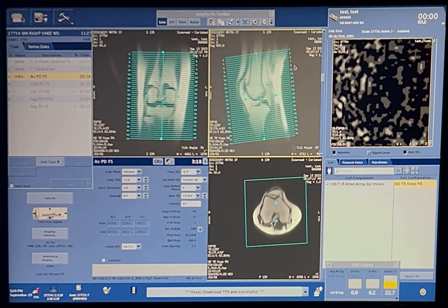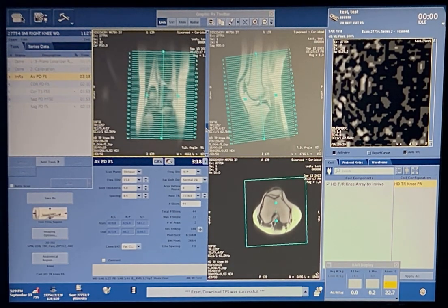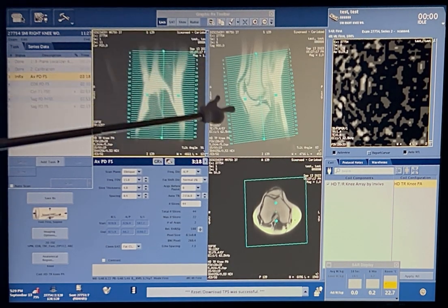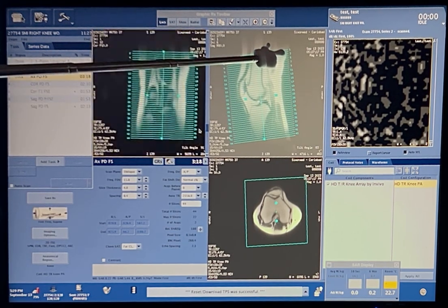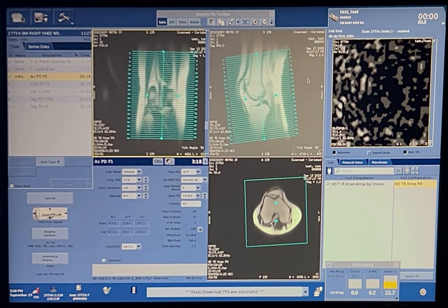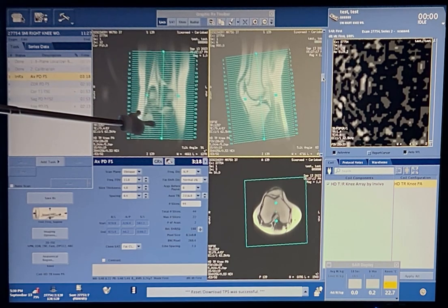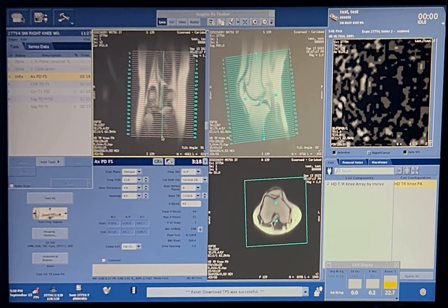Okay. So, coverage. You want to make sure that you're covering the sides of the knees, the anterior and posterior of the knee, if possible. Often if they have a really big thigh or leg, you're not going to be able to cover everything, like maybe in your top slices. See up here, even that's barely covering it. So just do your best. But okay, coverage. We only need the head of the fibula, so you can cut like 3 slices. Maybe 1 more. There you go, perfect.